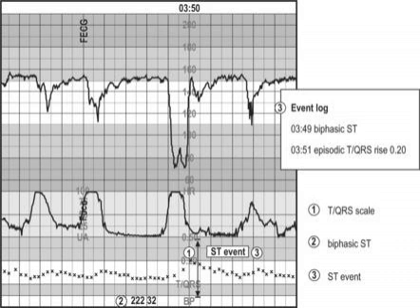Now, because we are measuring at a peripheral site, this is not a true indication of arterial oxygen saturation, but it's close enough for clinical work, and except in a few isolated cases, it actually correlates extremely well. This technology was iterated upon over the coming decades to improve its reliability and also to decrease the size of the probes. As I mentioned, it was commercialized by Japanese bioengineers in 1981 and made a huge splash in the medical world. As you can imagine, this especially revolutionized the delivery of anesthesia, where being able to keep an anesthetized patient well oxygenated is key to a good outcome.